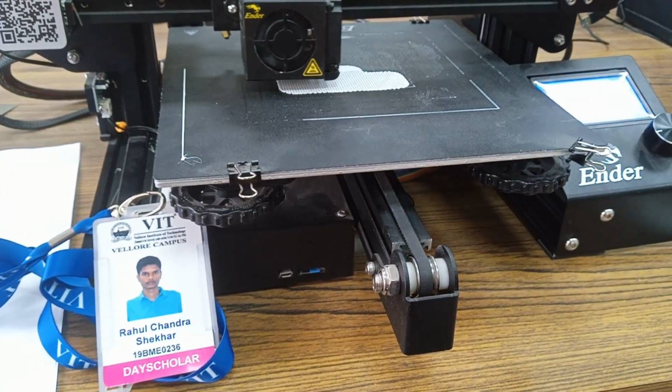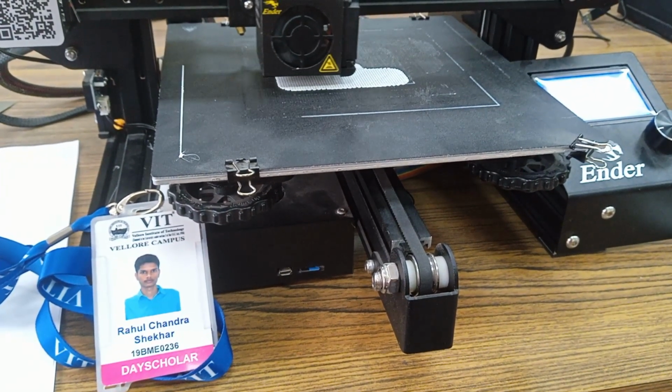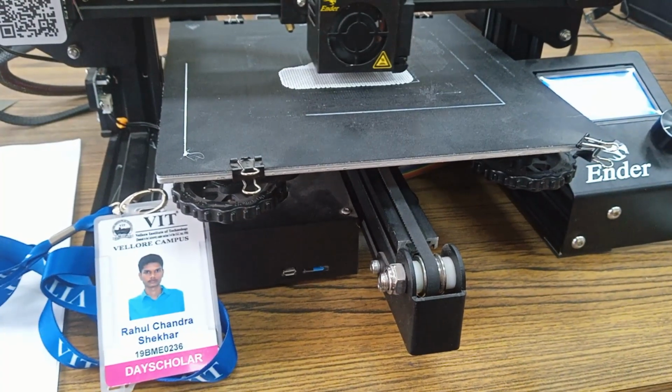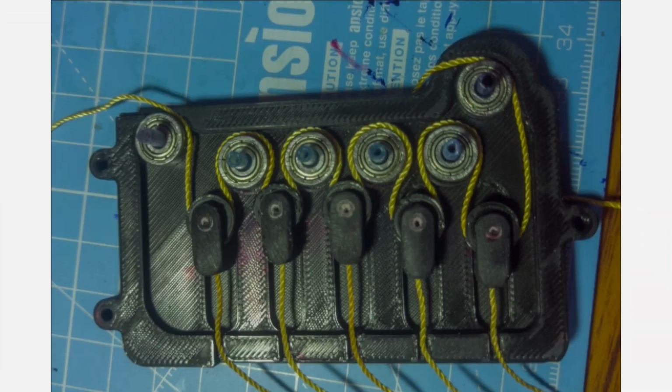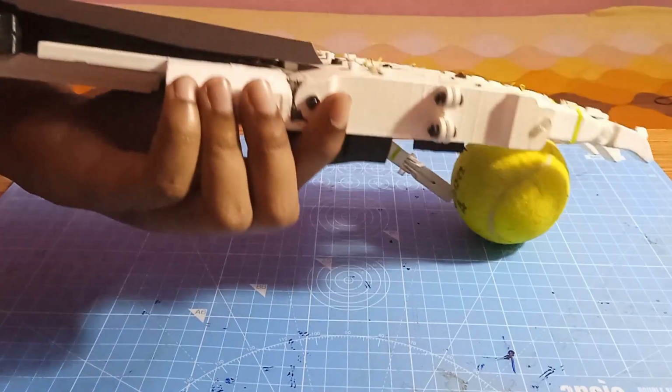Then we started printing all the parts of our design, which took more than 48 hours of printing time with 20% infill. After printing each part, we started assembling our model, starting from finger links towards the elbow joint. After printing the palm, we tested the adaptive grasping to grab various objects as shown in the video.